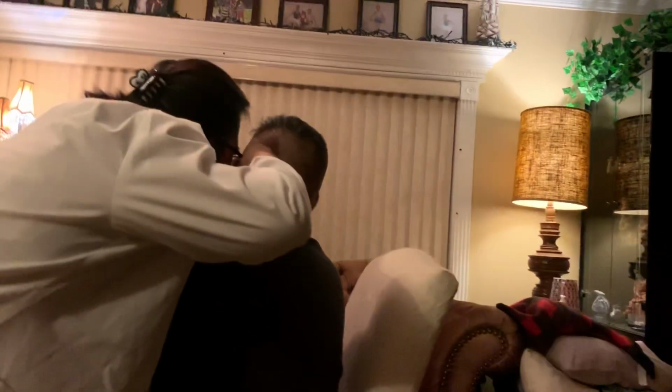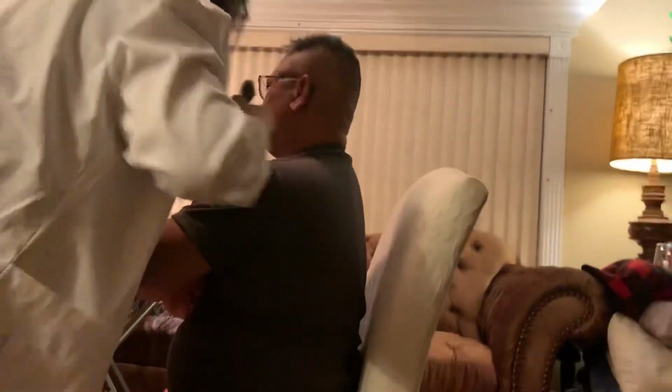So the next thing we're gonna do is, as I've said, I'll check using an otoscope. I'm going to check your external canal, your tympanic membrane, and the cone of light. All right, I could see your tympanic membrane. Your ear is dry, and there's no cerumen, there's no fluids. All right, let me just check for the cone of light. All right, and the cone of light is at 5 o'clock.